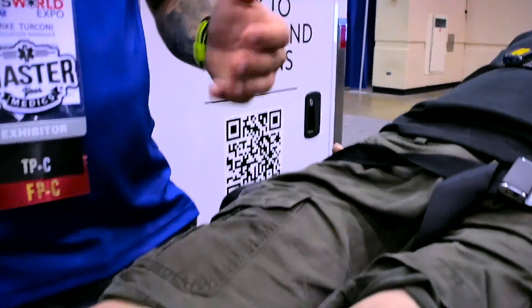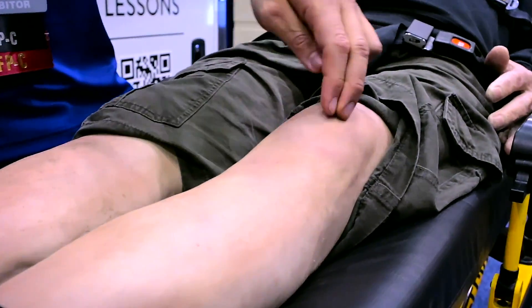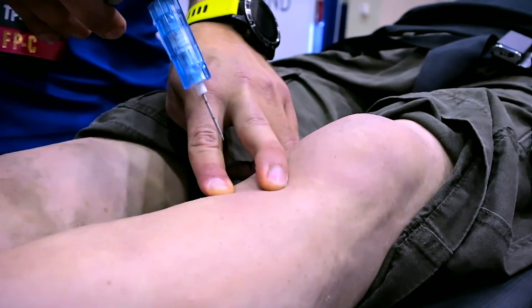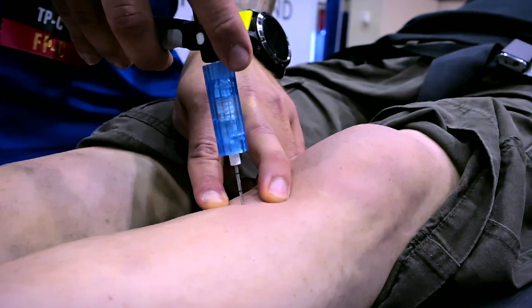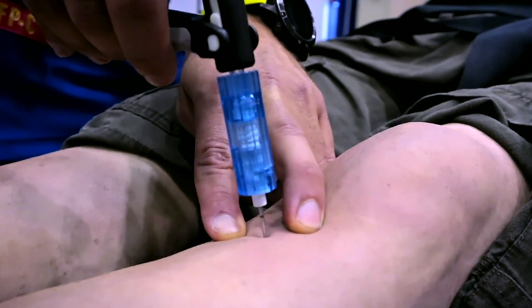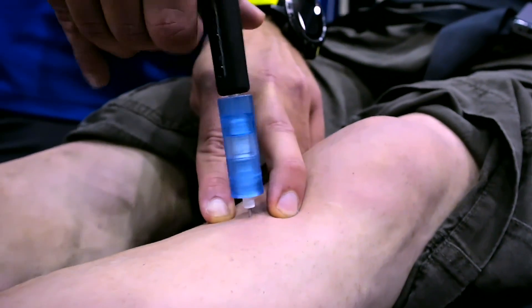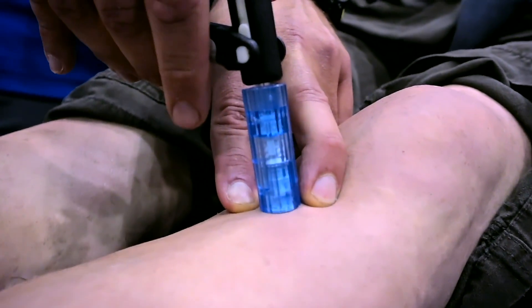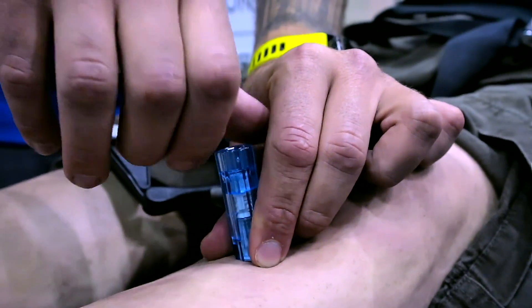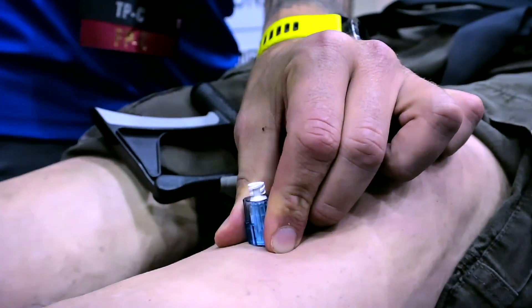How does this drill work? Very simply — find the landmark, remember two inches below the knee and two inches medial and you're right there. You want to go in perpendicular to the bone. Once you feel the needle pressing against the bone, rapidly press the trigger on the drill until the needle is in, and then you remove the guiding needle.